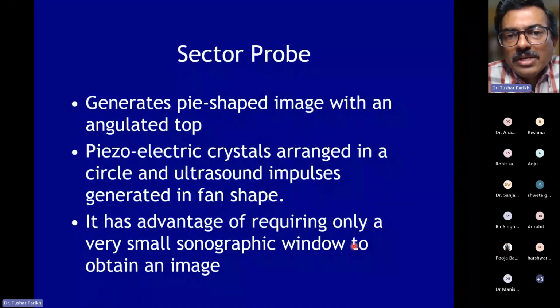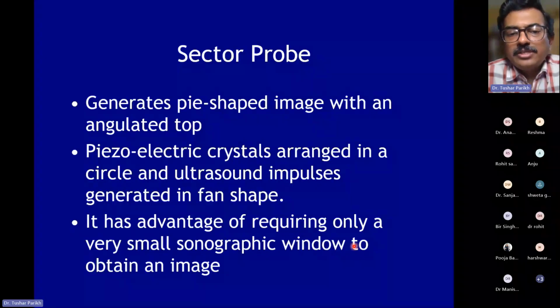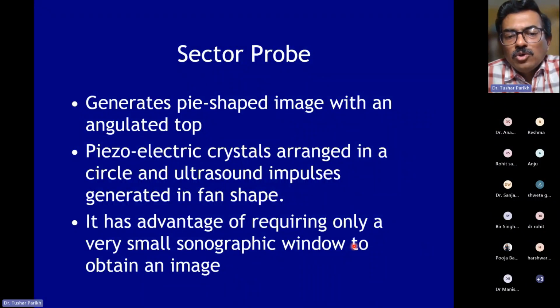Now, these are the sector probes, which generally generate a pie-shaped image. The piezoelectric crystals are arranged in a circle, and the ultrasound impulse is generated in a fan-shaped manner from the center. It has the advantage of requiring only a very small sonographic window to obtain an image.